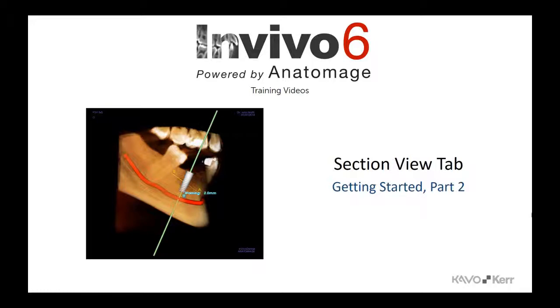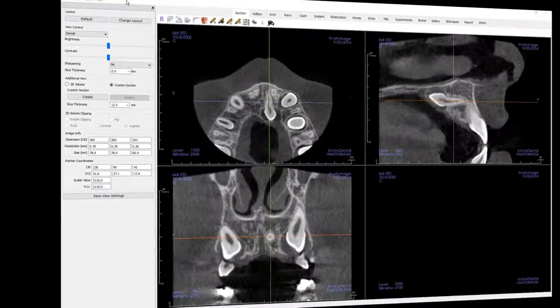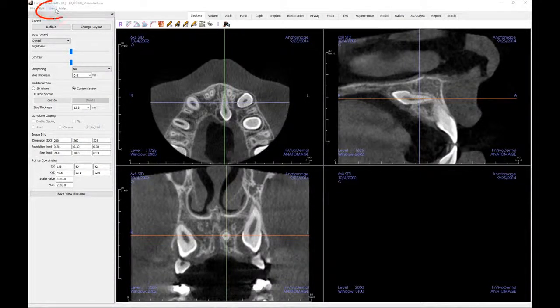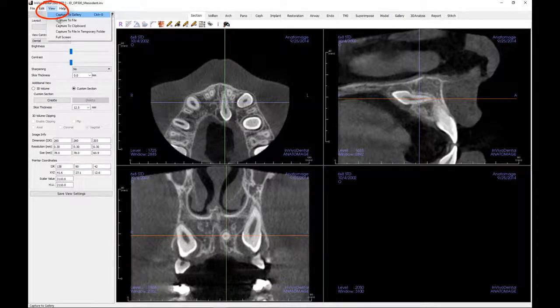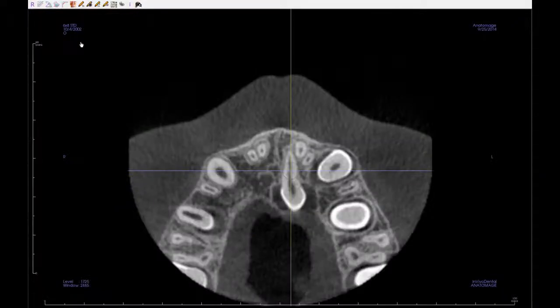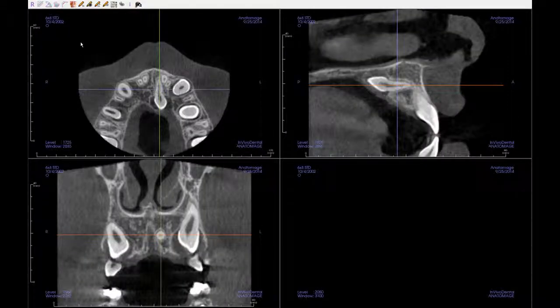We will look at additional viewing preferences. You may view only the rendering window and toolbar if desired. To do so, select View in the menu bar and select Full Screen. You can still isolate one of the viewing windows by double mouse-clicking on it. Click the keyboard escape key to revert to the default view.